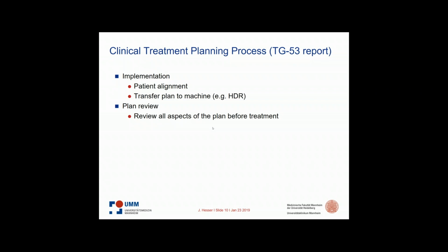It's always recommended to check before we really do the treatment, so as not to harm the patient. You check, okay, is everything okay? Was there any error in there? And then you can go on. So I hope that I answered these two questions from the chat. Are there other questions coming up?